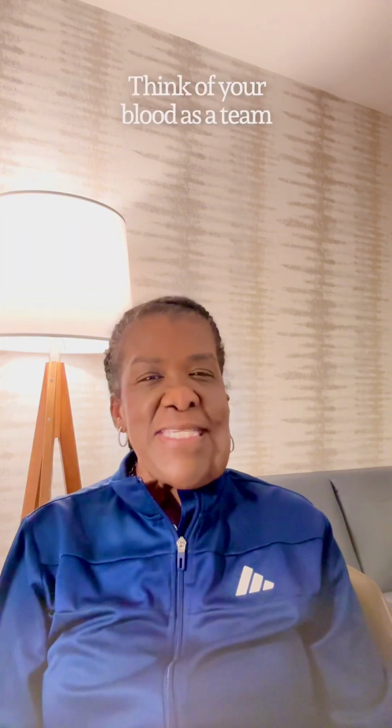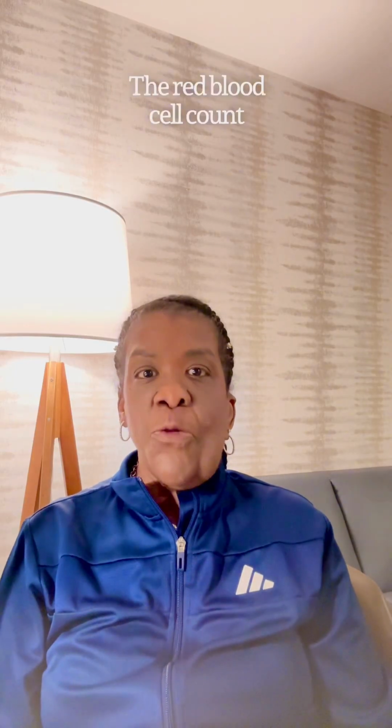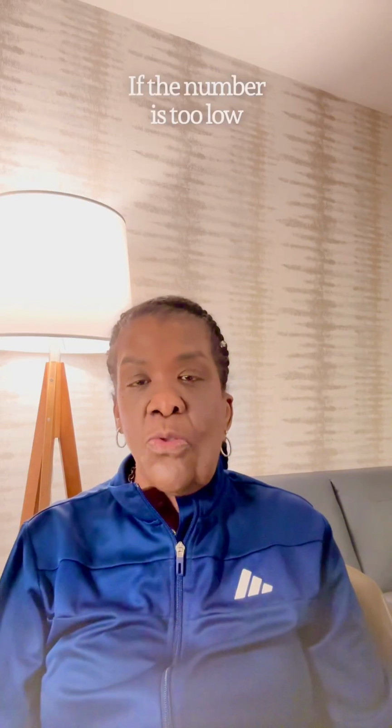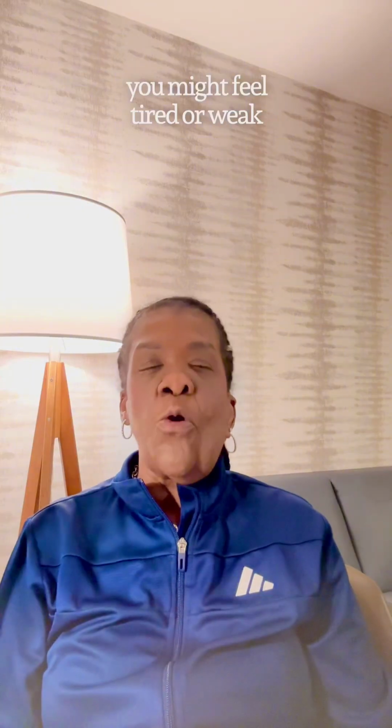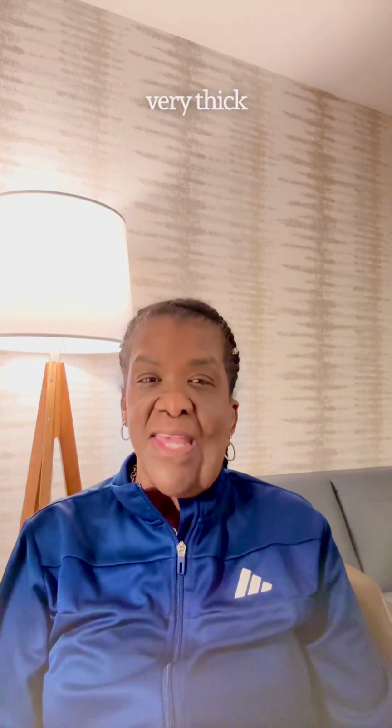Think of your blood as a team. Each part of the team has a special job. First, let's talk about red blood cells. The red blood cells carry oxygen from your lungs to the rest of your body. Oxygen gives your body energy. The red blood cell count tells us how many red blood cells you have. If the number is too low, you might feel tired or weak. If it is too high, your blood can become very thick.